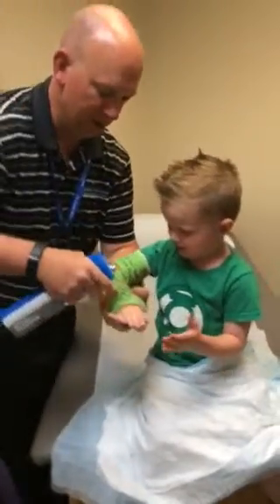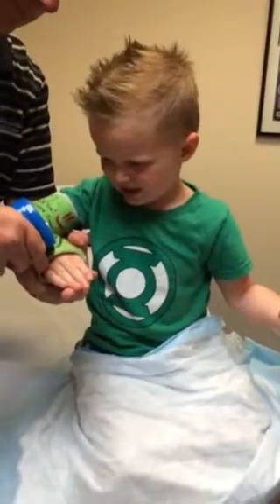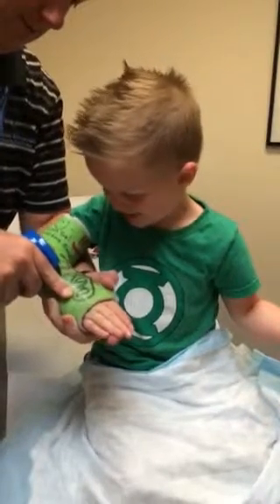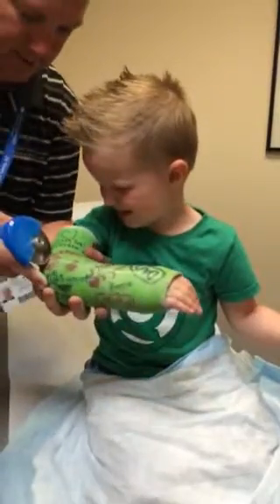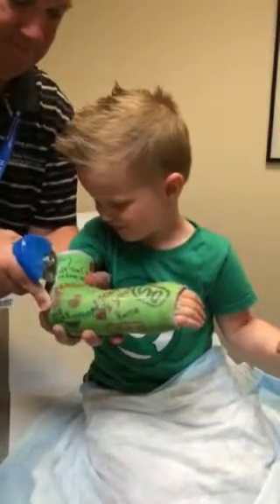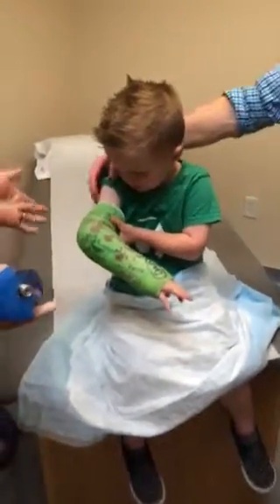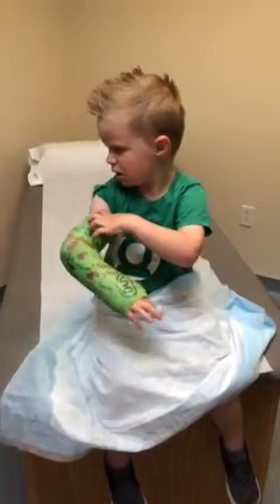We're almost done. Push your fingers all the way down now. We're just going to be covered in fiberglass today. Our vacuum didn't suck up the powder, so me and you are just covered in fiberglass. I'll have to kick it once or twice.